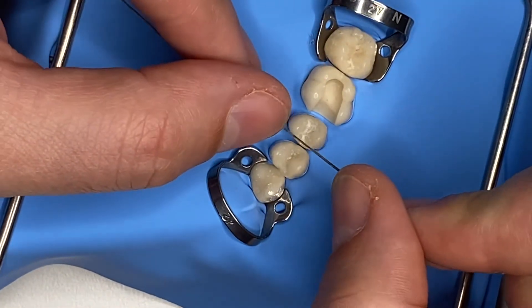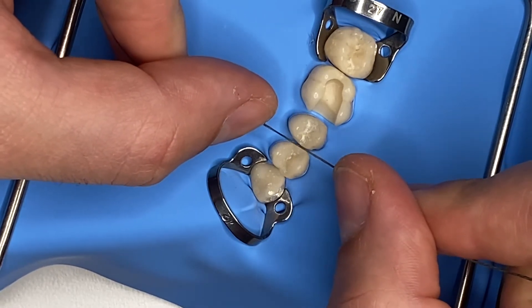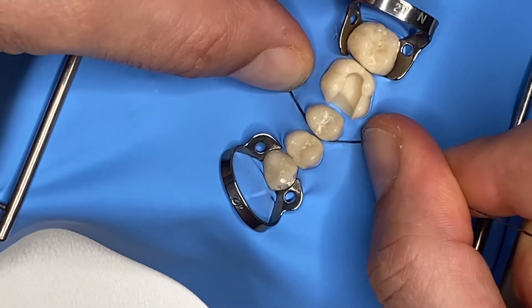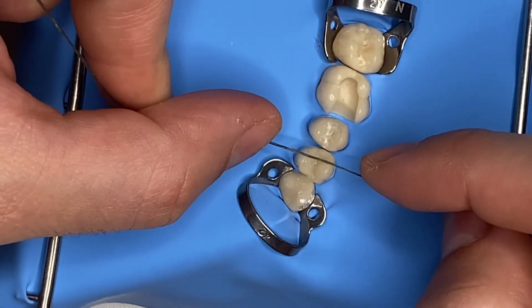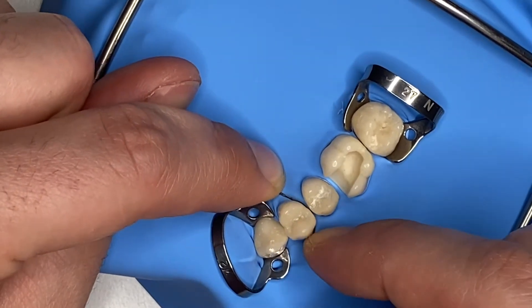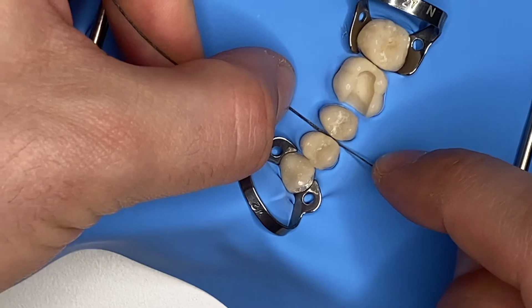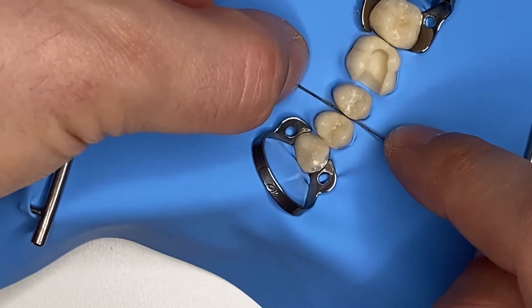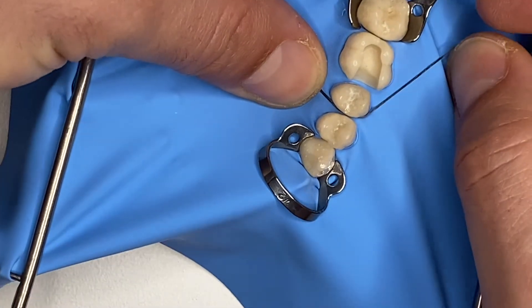If I'm going to first decide that I'm going to follow the mesial side of tooth 1.5, I'm just going to hold my floss in contact with tooth 1.5, then I'm going to follow the distal wall of tooth 1.4. I'm only going to follow the distal side of tooth 1.4. As you can see, I'm not going between the teeth and applying pressure — this will cut the rubber dam for sure, especially if it's still caught between teeth. What I want to do is make a nice letter C around the tooth that I'm following.